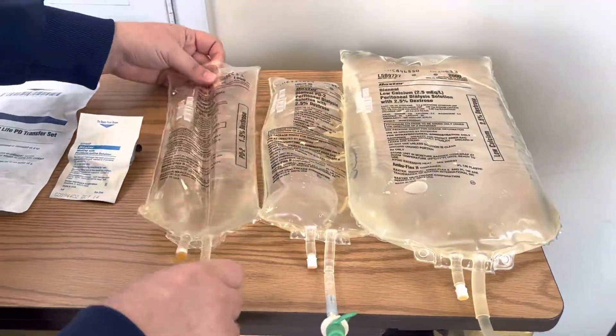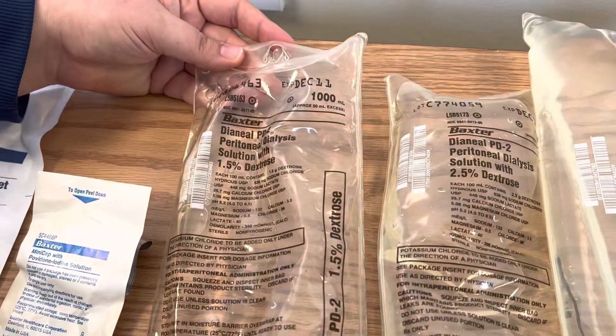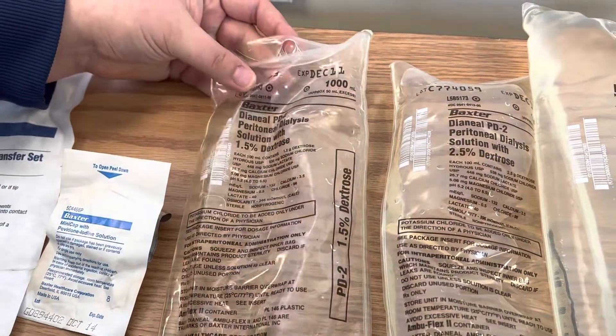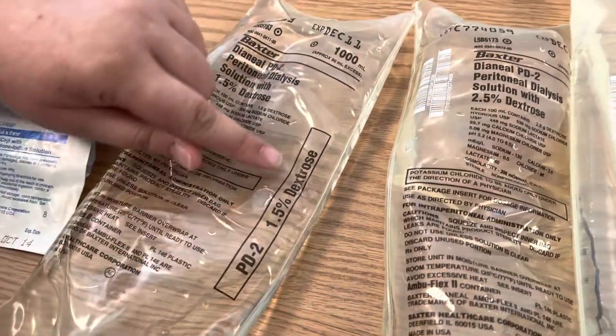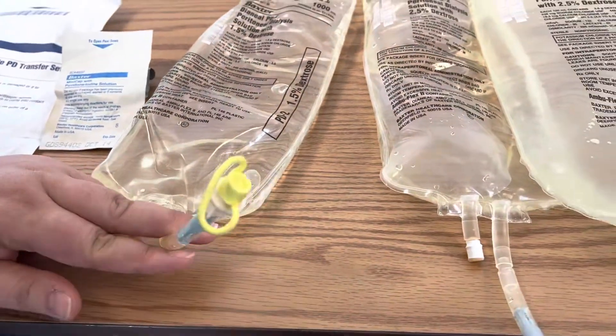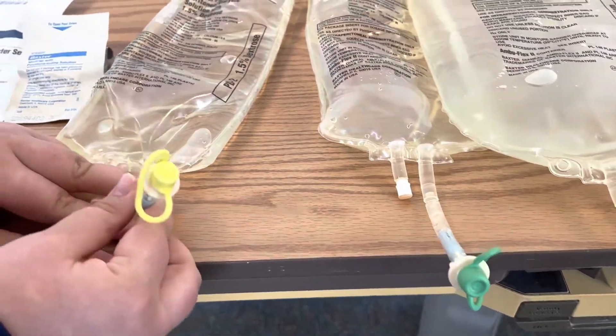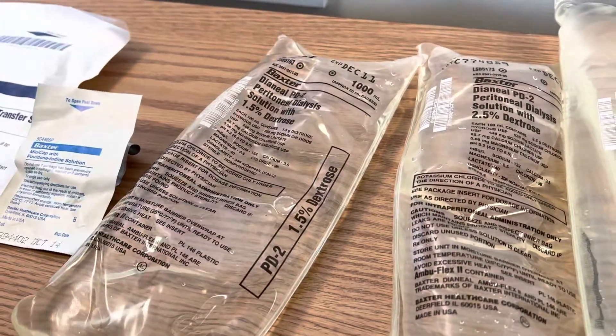Now on these bags there are a couple of things you want to be checking. You should remember the acronym SEAL. SEAL stands for 'solution,' meaning you want to look at the percentage of the dextrose that's on the bag. On the end of these bags there are colorful little caps that indicate and are color-coded for the percentage of the dextrose that you'll be giving.